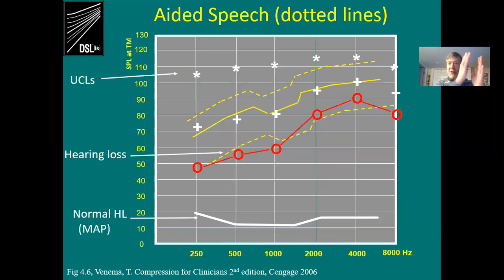So you can think of three chapters. Functional gain in the old days with linear hearing aids. Then still linear hearing aids, but Real Ear measurement came out, and so instead of using functional gain, you're using insertion gain. With functional gain, you might have been using half gain rule, Berger, Libby, Pogo, NAL-R. With insertion gain, you might have been using half gain, Libby, Pogo, NAL-R, doesn't matter. Then came DSL, and with it came speech mapping.